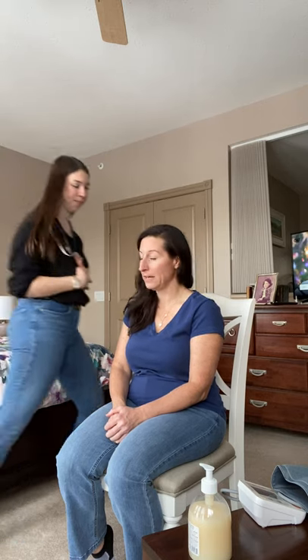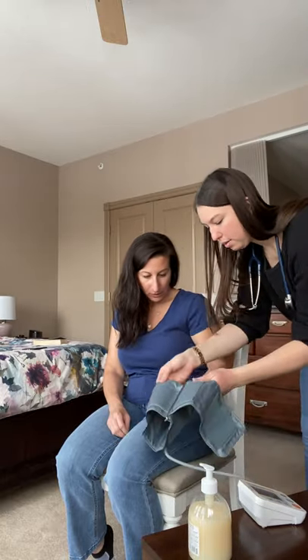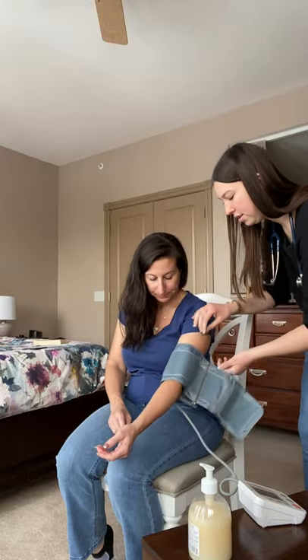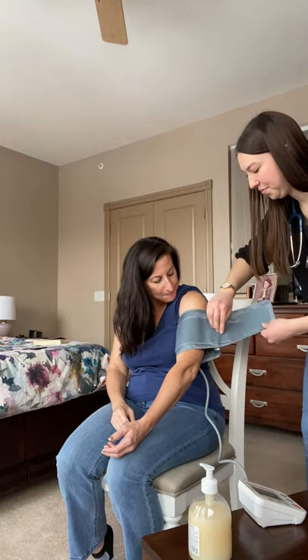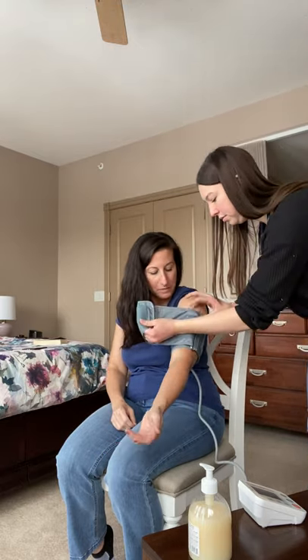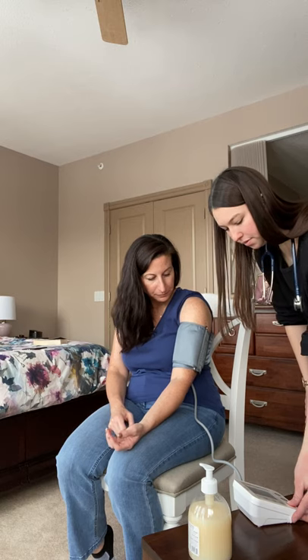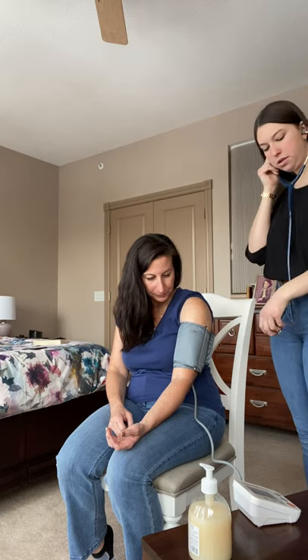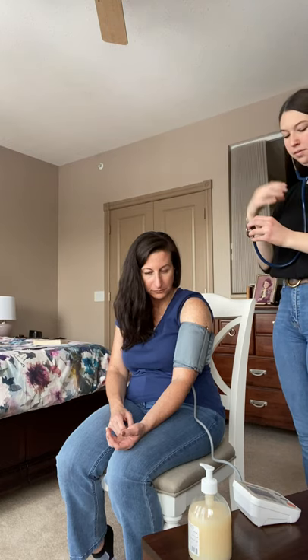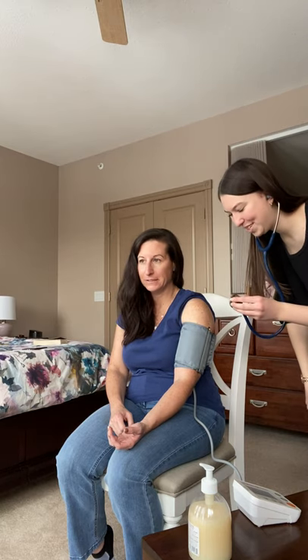I'm going to move ahead to your blood pressure, if that's all right. I'm just going to get you to place your arm straight out for me and put this inside, please. I'm going to roll up your sleeve as well. The cuff is going to get very tight — that's alright, just breathe normally.